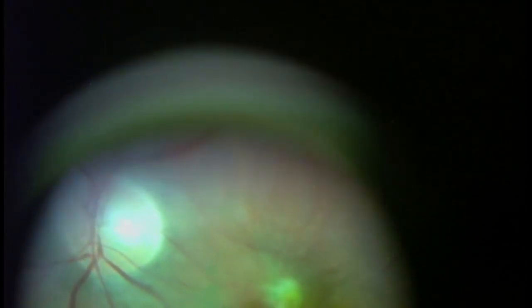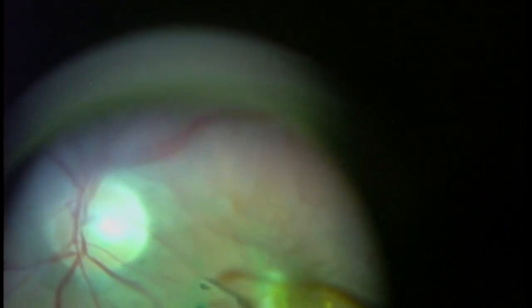I'm really trying to clean the fovea or the macula—that's that yellow-orange area to the right of the forceps—as normal as possible. That bright white oval with the blood vessels coming out of it is the optic nerve.